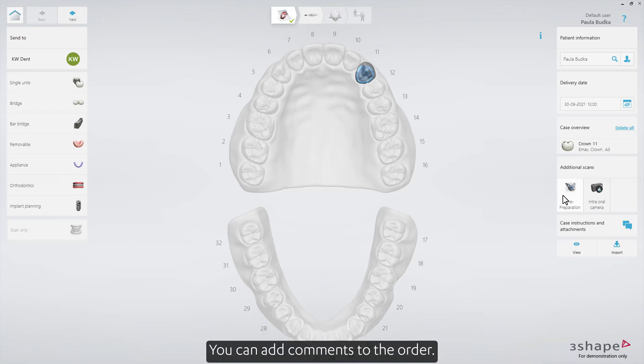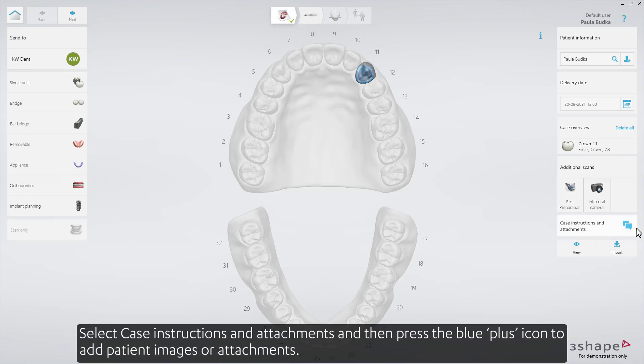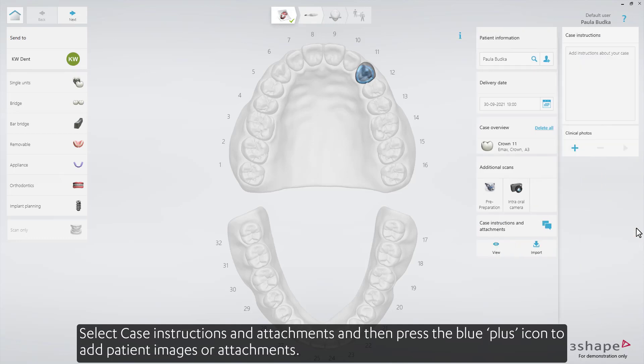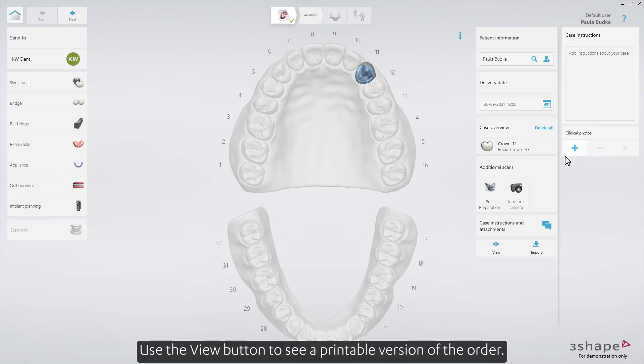You can add comments to the order. Select Case Instructions and Attachments, and then press the blue plus icon to add patient images or attachments. Use the View button to see a printable version of the order.